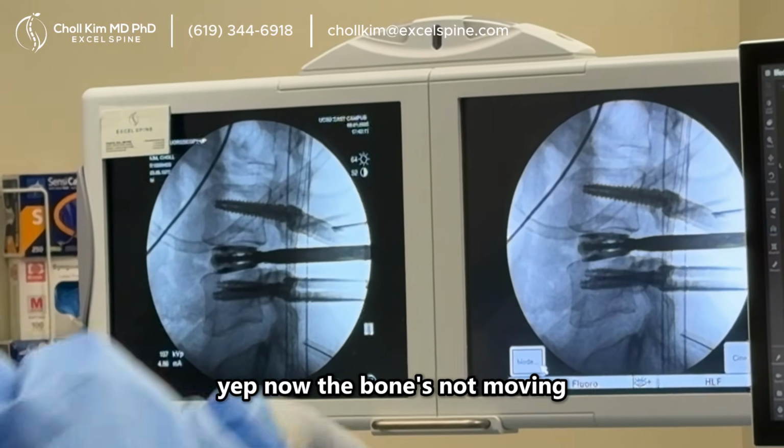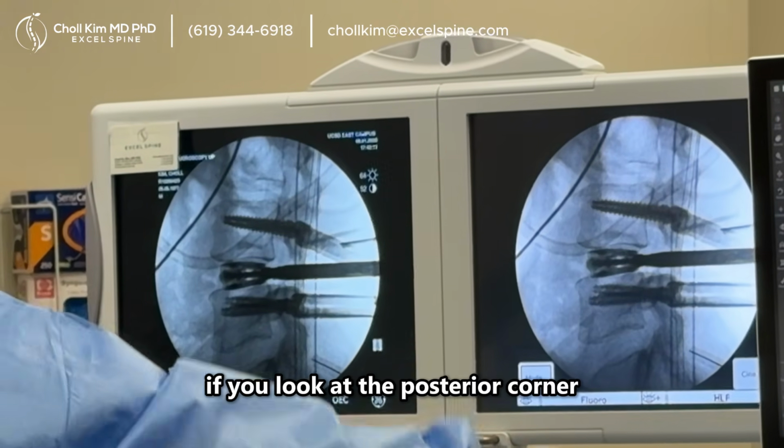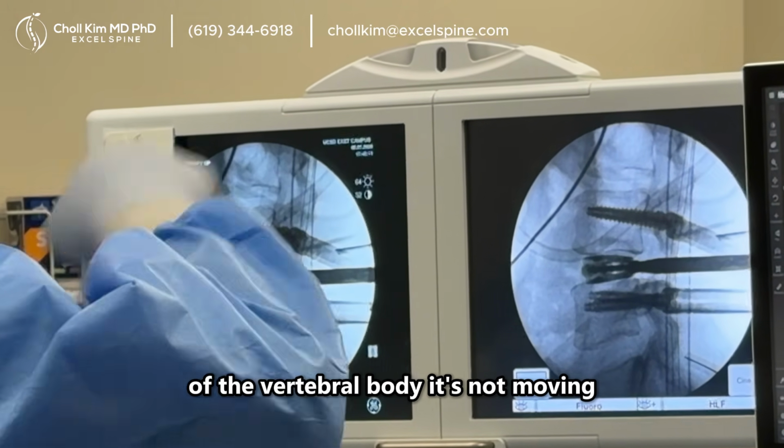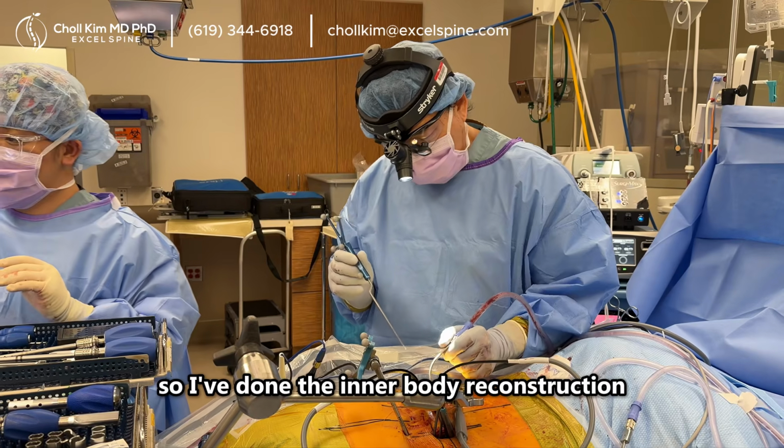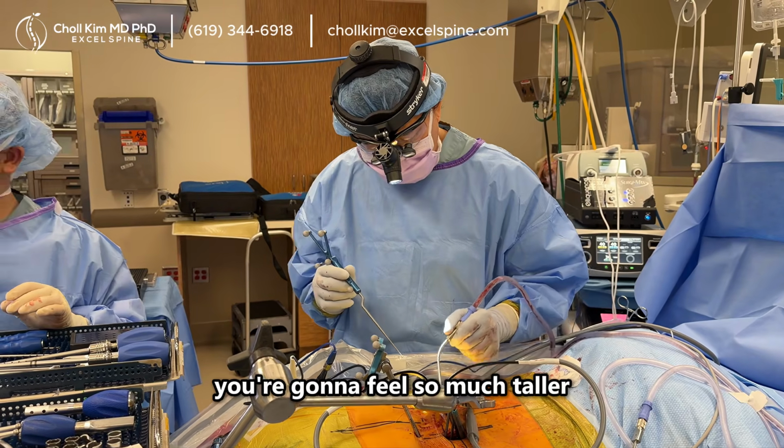Yep, now the bone's not moving. You look at the posterior corner of the vertebral body. It's not moving. Everything else is moving like a bowel gas. So I've done the interbody reconstruction. You're going to feel so much taller.